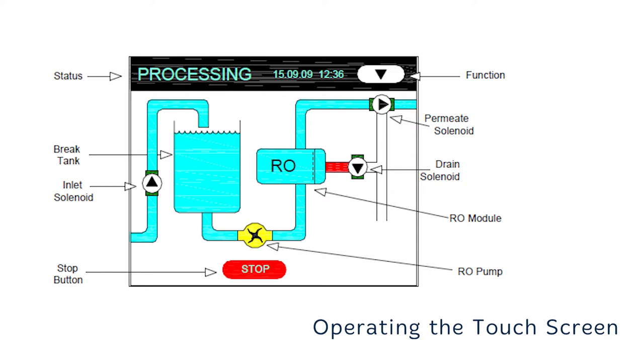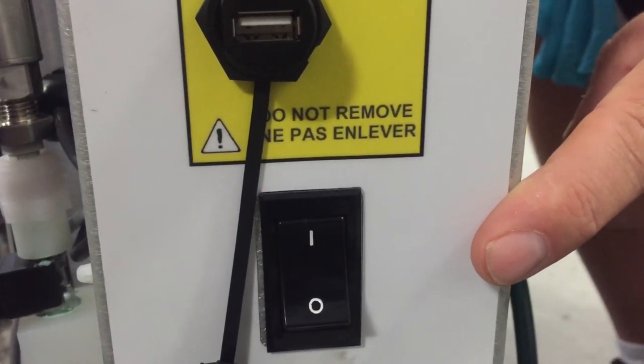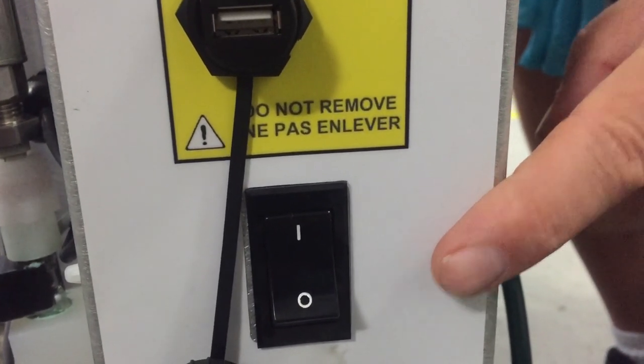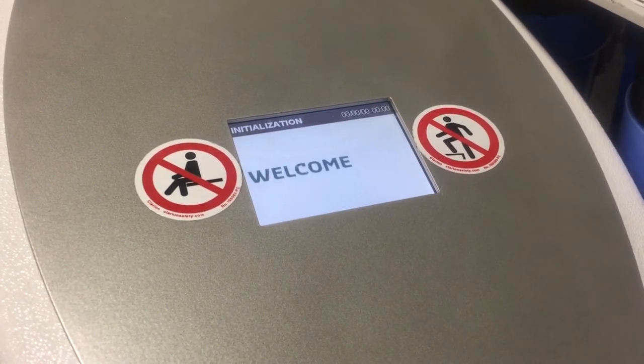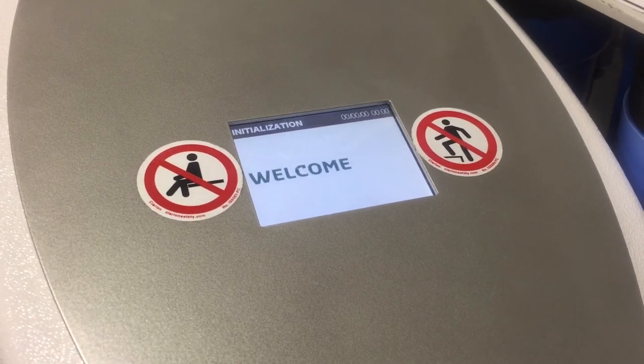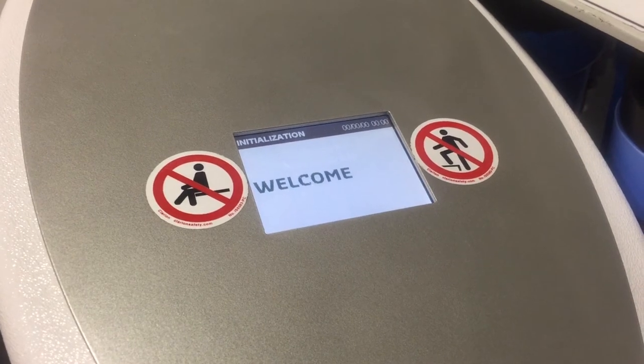Pressing the start button on the unit will go into processing mode and start to produce purified water. To begin an initial start-up procedure, first carry out the pre-dialysis checks detailed in the user manual. Then switch on the unit using the on-off switch in the rear of the unit, switching it to the one position. The touch screen will initially display initialization for a few seconds before showing the power on screen, which displays the current date, time, model type, and any active messages.